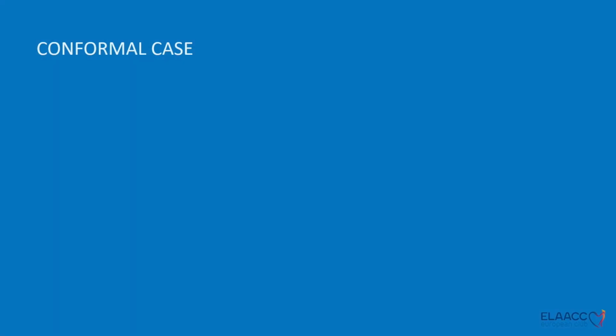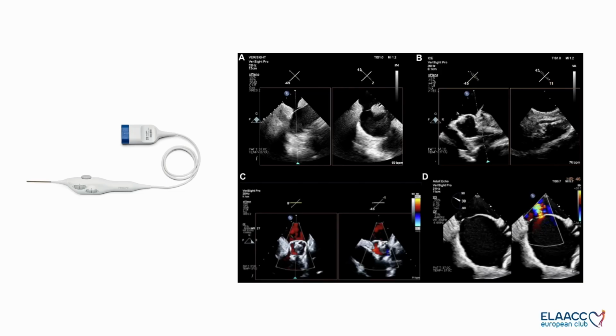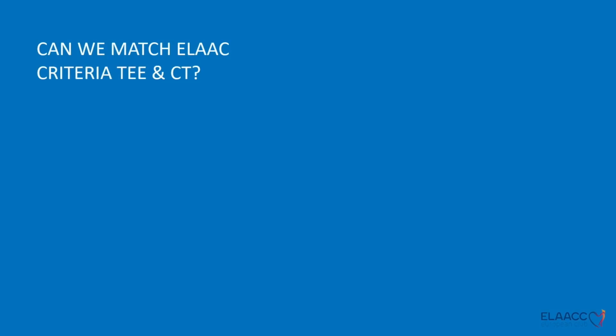We have also seen a conformal case, and it was nicely demonstrated what the possibilities of this new device are, and Jens Erik also showed us a Philips case with this new ICE probe, and then we also have the experience from the Mayo Clinic, and some attendees here who have experience with this. To be honest, the quality of the images you can see here is amazing, and maybe it's something that we can consider in the near future, as we have just discussed.